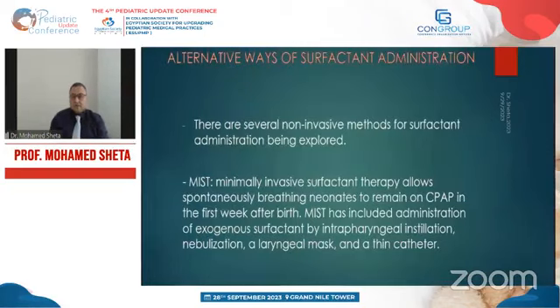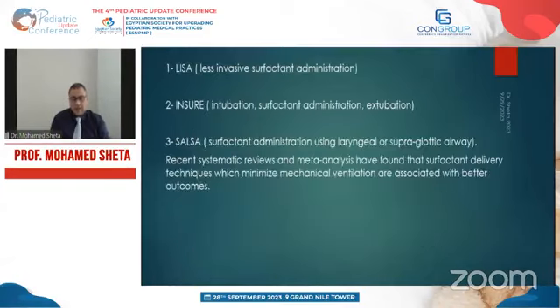We have many alternative ways to give surfactant nowadays. There are several ways. There is the MIST technique, which is minimally invasive surfactant therapy, allowing a spontaneously breathing infant to remain on CPAP in the first week after birth. MIST has included administration of exogenous surfactant by intrapharyngeal instillation or nebulization or laryngeal mask and thin catheter. So we have the LISA technique. LISA technique is less invasive surfactant administration. We will use Surfcath, and we will show you in the next slides.